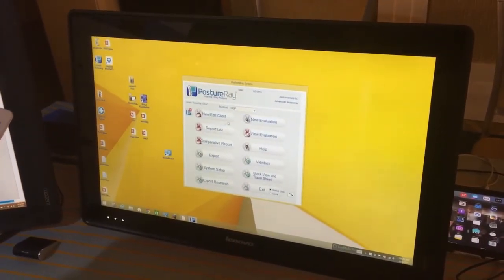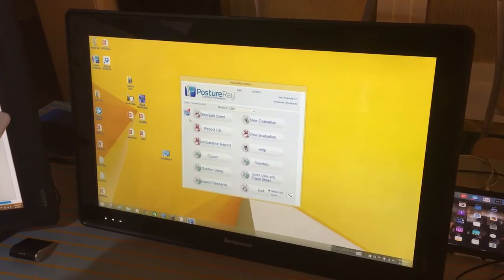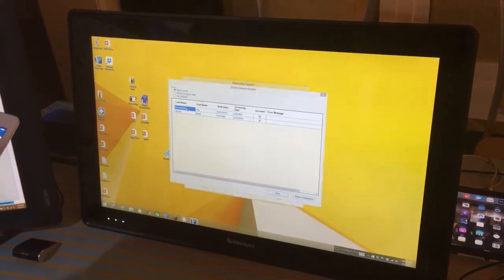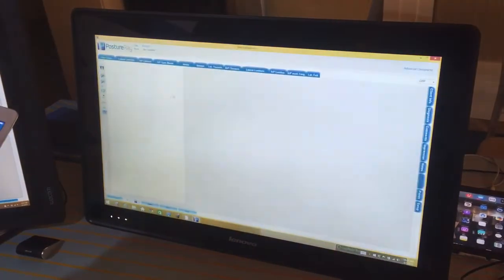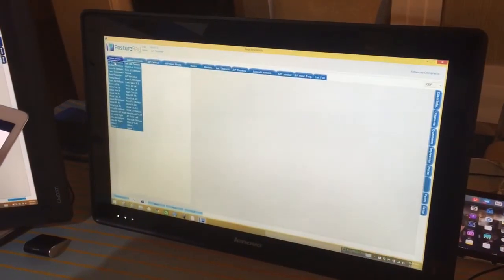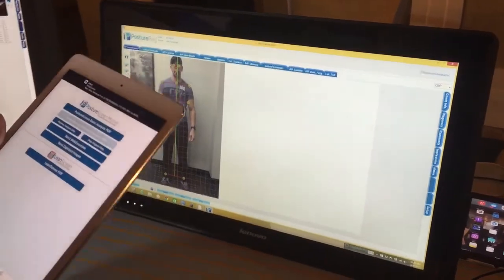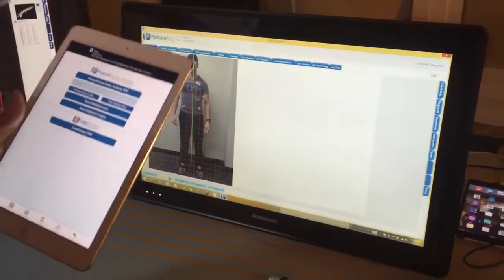If I go in, I can click Ferrantelli, and now my images are already in Posture A.